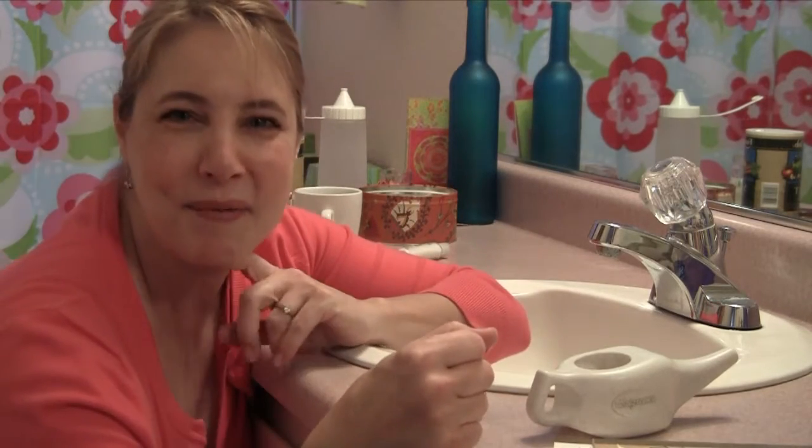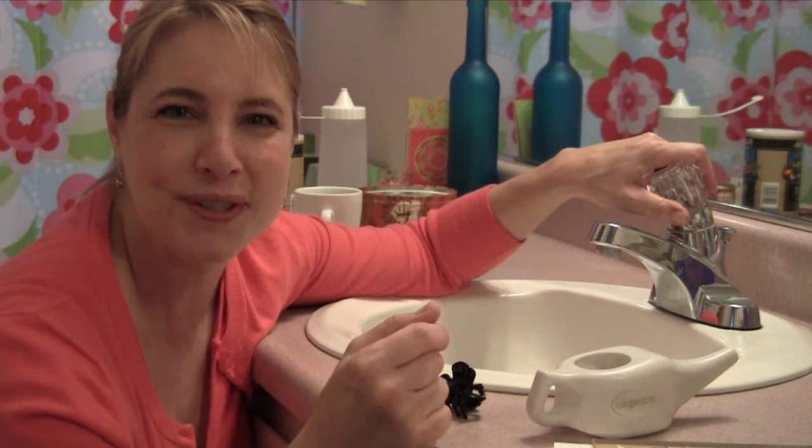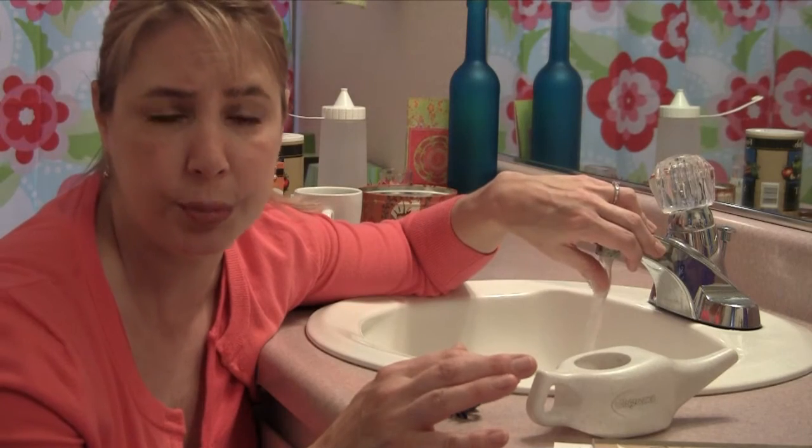Okay, so here we are now, guys. We're back at the sink, and I'm way down here low with you because in just a second I'm going to be pouring water through my nose. I'm going to actually let you watch. It's kind of weird to watch the first time, but I'm going to show you how it works. I want body temperature water, so bear with me here.